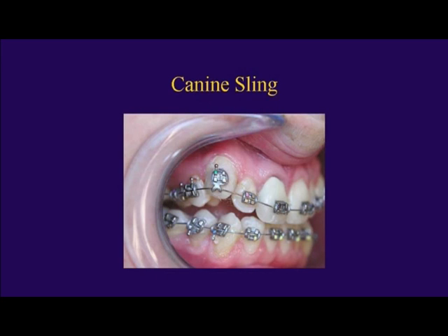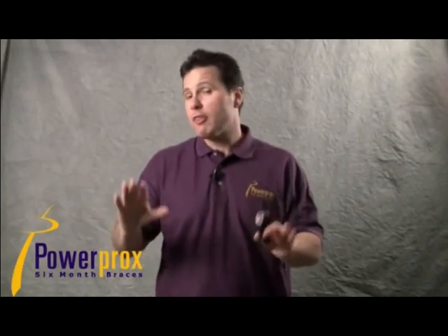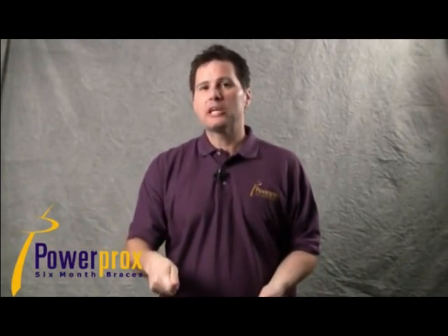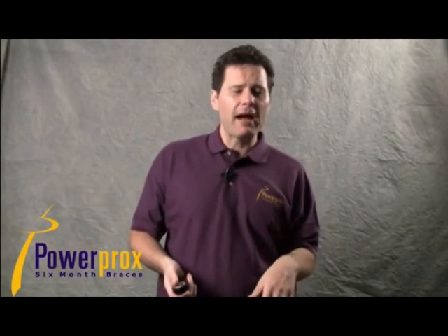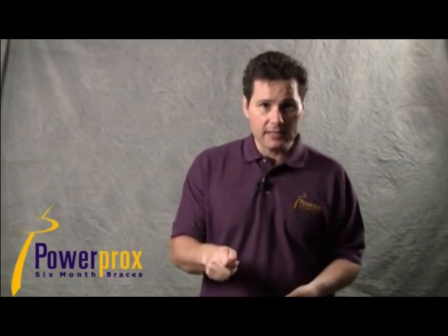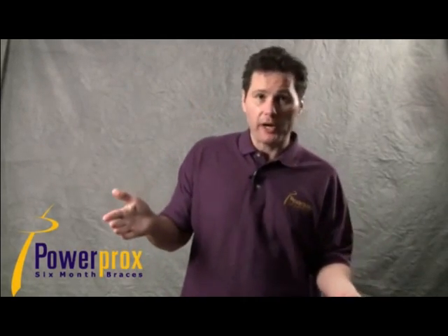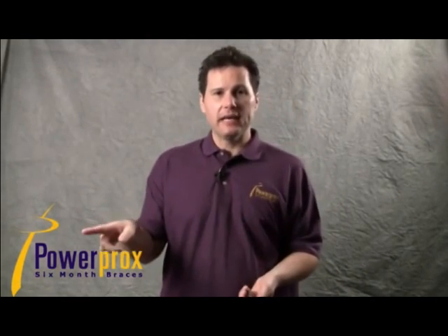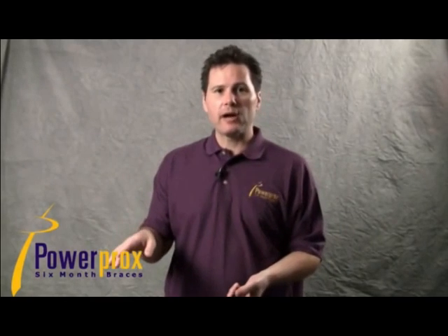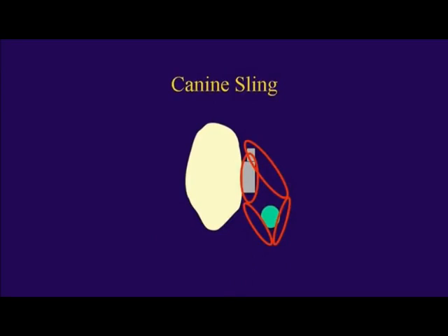Now you could do the big step bend with a piggyback. That would also work. But here's a really quick and easy way to do it, what I call the canine sling. It's just a neat little power chain trick. Take about a 4-unit power chain and place it on that canine bracket before you have an arch wire going anywhere near it. Okay? Then what you do is you tie in the arch wire everywhere else, and then you're going to just loop that power chain over those remaining units.